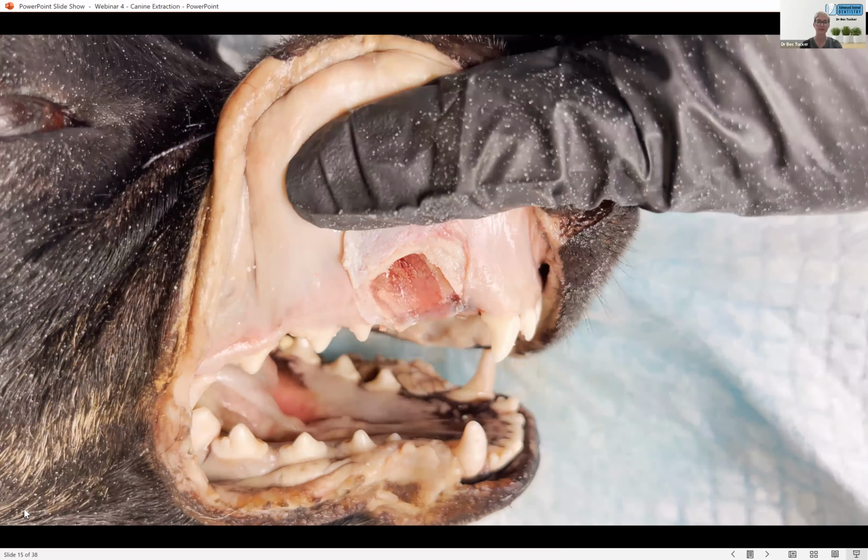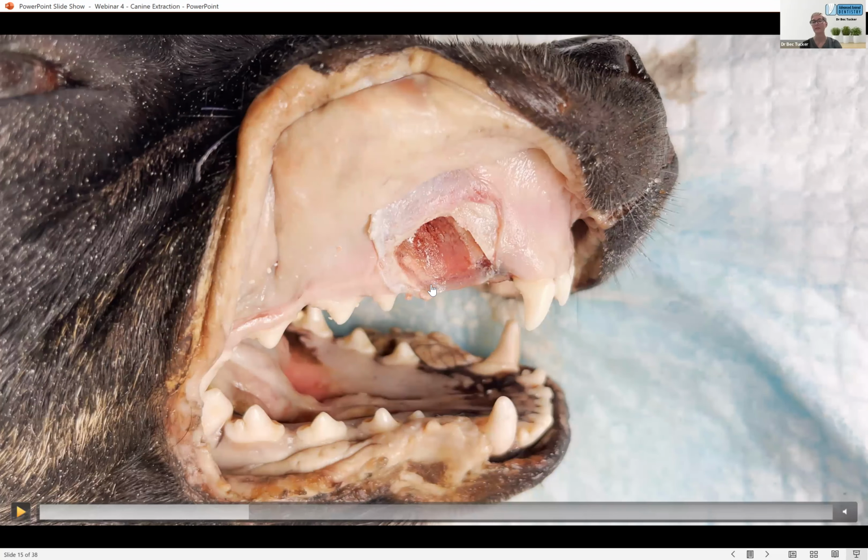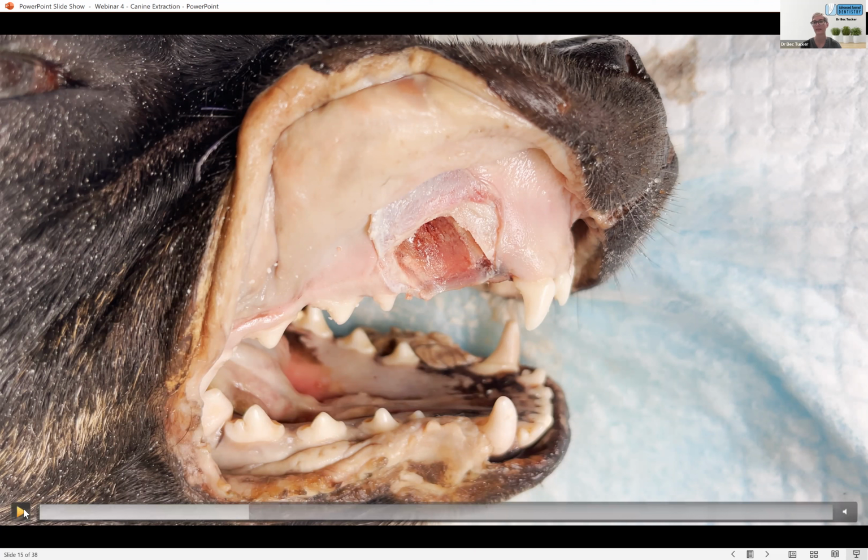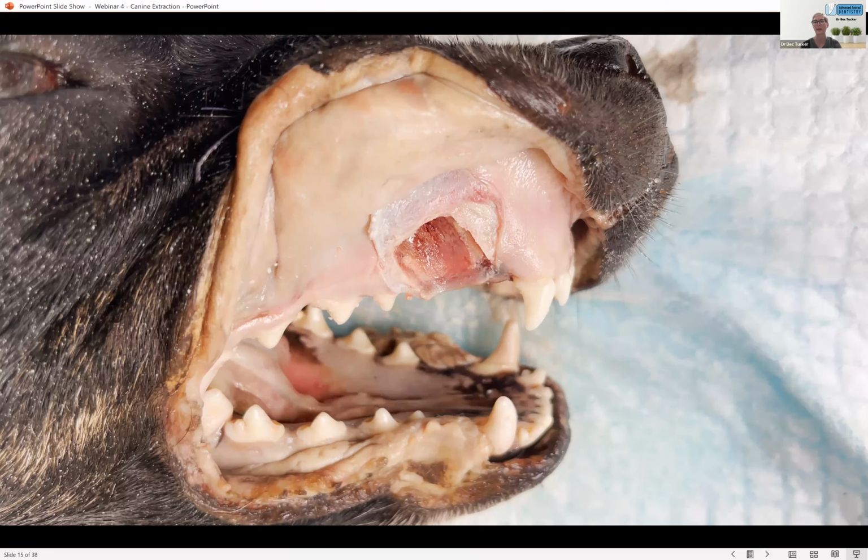The other thing, I guess, and it's not really relevant in this particular individual, is often when you have advanced periodontal disease or you've got an oronasal fistula, for example, you'll have invasion of like granulation tissue or epithelium up the palatal side of the tooth, so on this bony surface. You always want to make sure you debride that really well. It's imperative, if you have an oronasal fistula, that you clean that up and you get a really nice fresh tissue margin with no invasion of that tissue into bone, or you're almost guaranteed to have a breakdown. So really make sure you curette any debris out of the actual alveolus, but also that you really, really, really need to just debride and clean up that palatal mucosal surface if there is damage to it or invasion of tissue up that palatal aspect of the tooth.